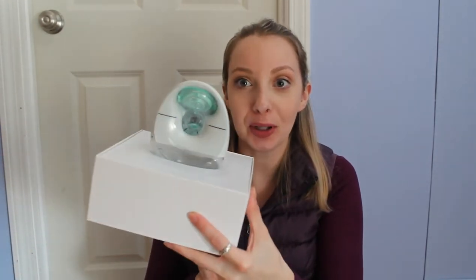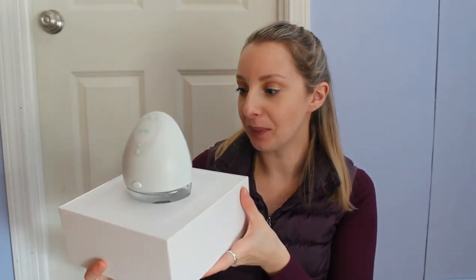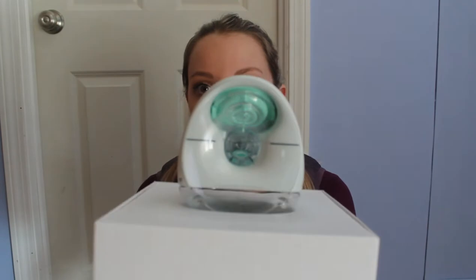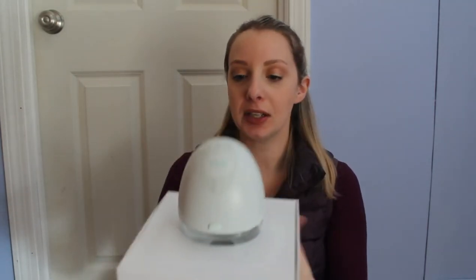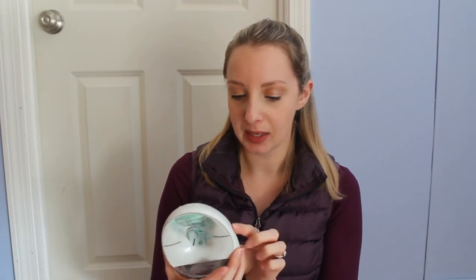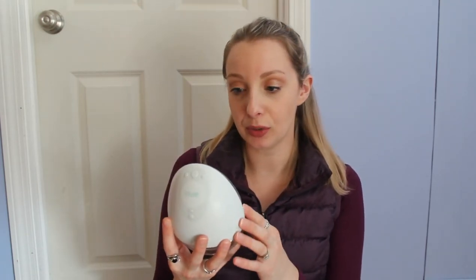So the box just pulls off like this. Oh my gosh, you guys — wow, this is so much smaller than I thought. I honestly thought it was going to be huge. This is like an alien egg. So this is the part where your nipple goes in — this is the front. And it's totally a lot lighter than I thought it was going to be. Love the look of it. It would definitely make me — I'm not very big chested — look like I have some serious boobs, but that's all right.